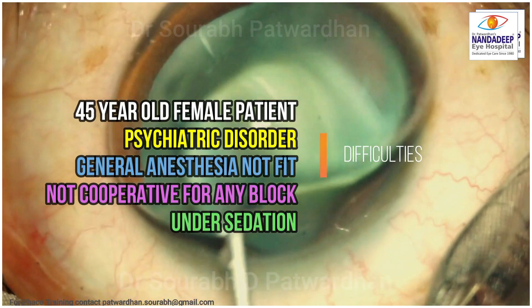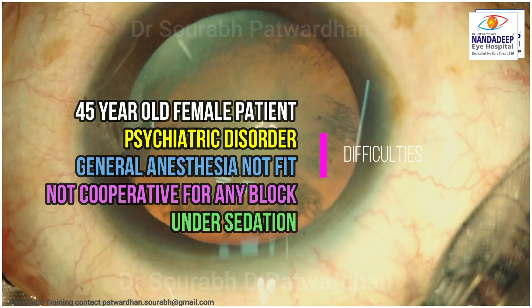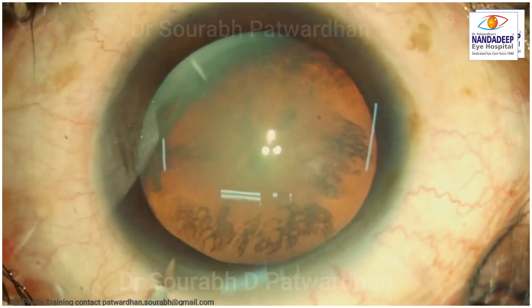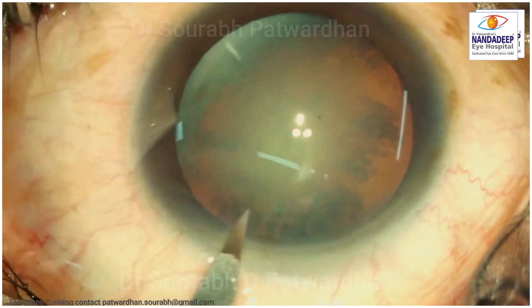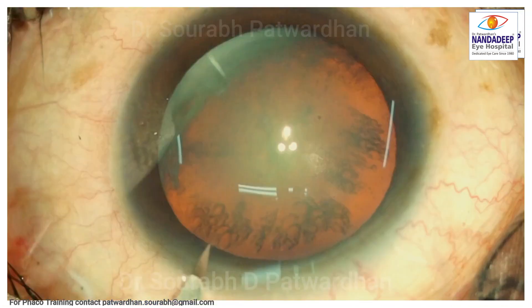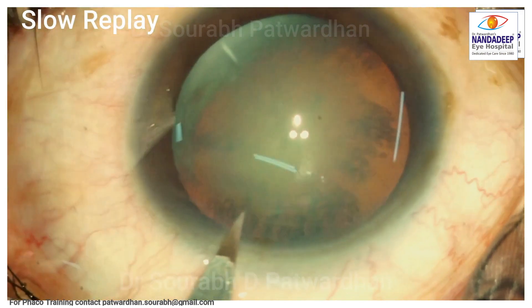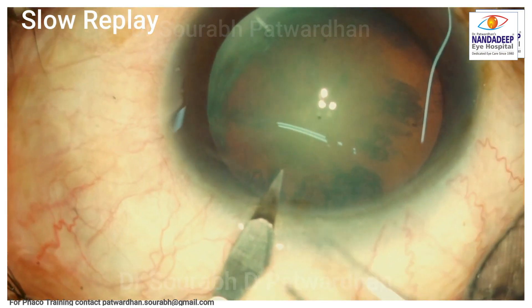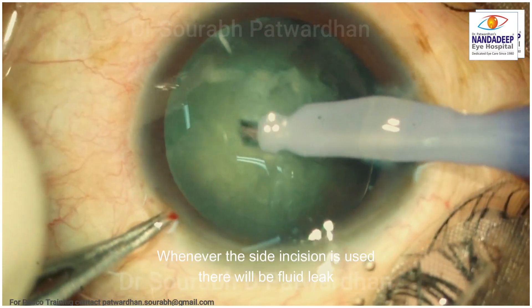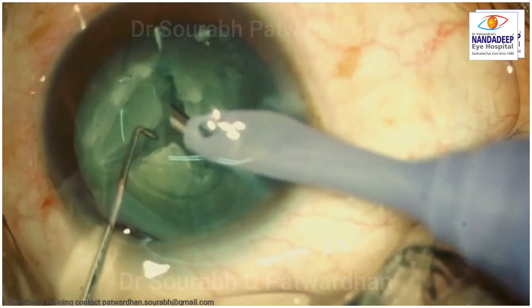So this is the first case, a 45 year old patient who is uncooperative and not fit for general anesthesia. We sedated the patient and thought we would be able to carry out the surgery. The blade goes in and even before I could stabilize the globe, the patient moves the eye and there is a very big side incision created, which was not intended. Whenever this side incision is used, it will leak profusely, causing problems in the fluidics of the surgery.